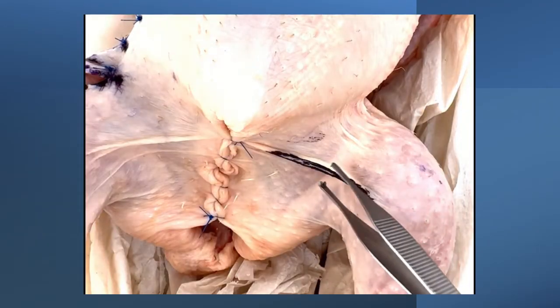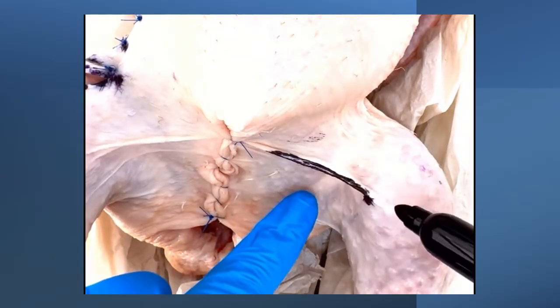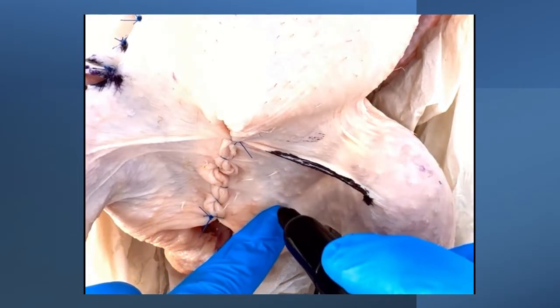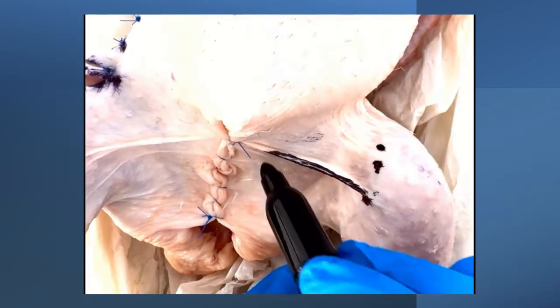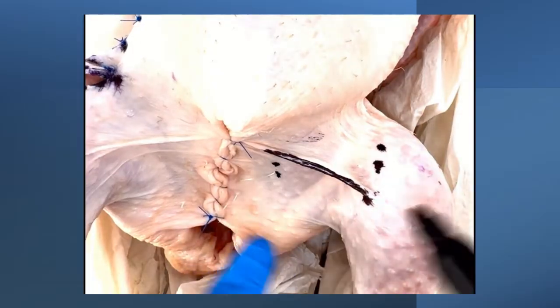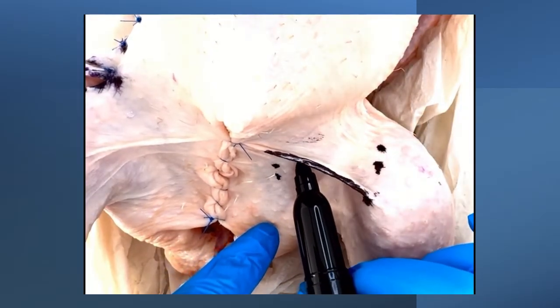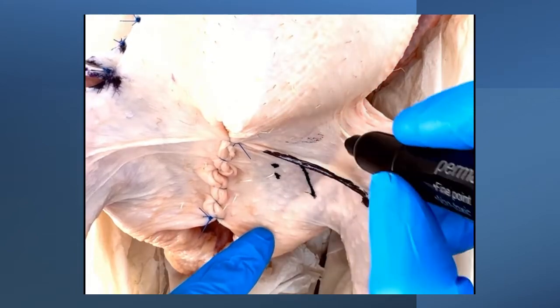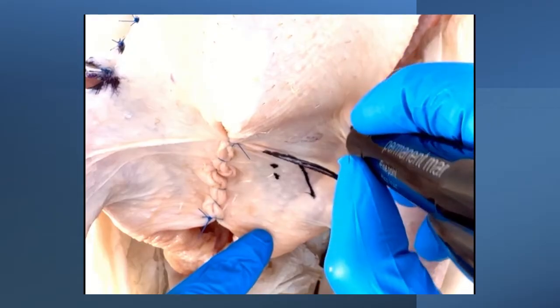We'll demonstrate this again in the groin crease of the chicken. Now this is to demonstrate that you don't have to use the entire scar to perform the Z-plasty. So you can just use it as a fire break in the center. This is useful when you have large scars, like some that you might get across your nasolabial fold, and you just want a fire break just in the middle to reorientate that scar and prevent the tethering across a depression.